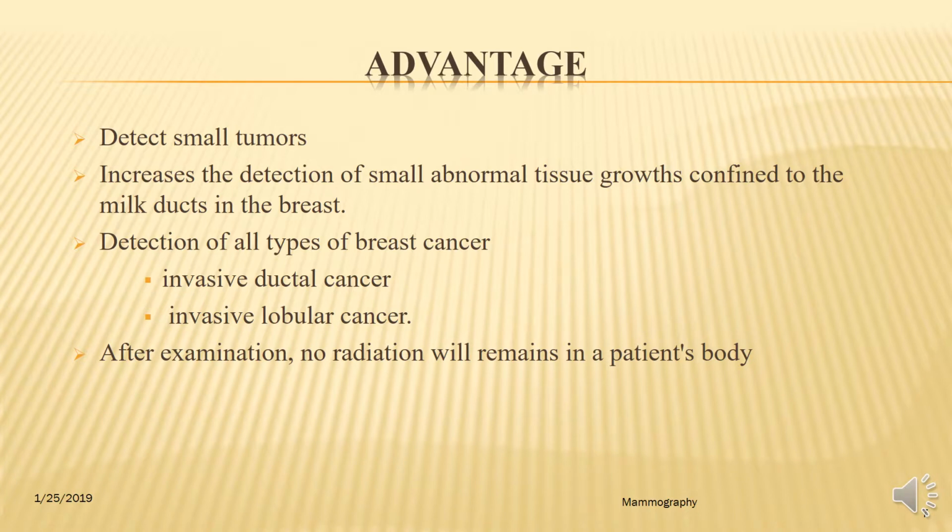There are different advantages of a mammography device. Some of them are listed here. The imaging of the breast improves a physician's ability to detect small tumors. When cancers are small, the patient has more treatment options.